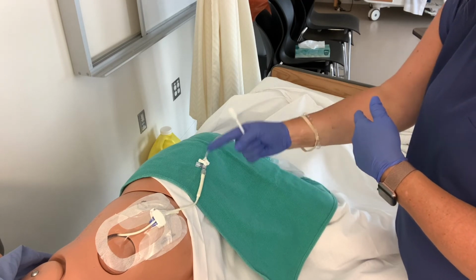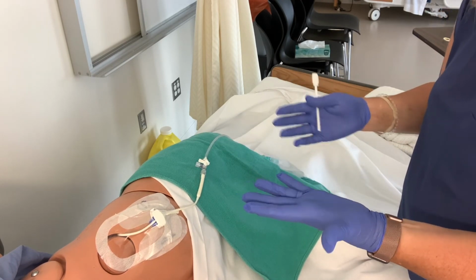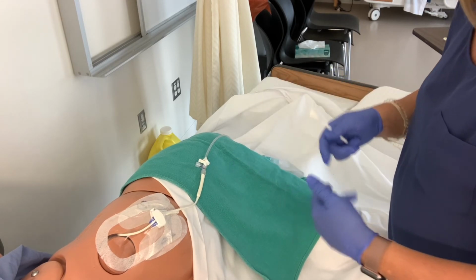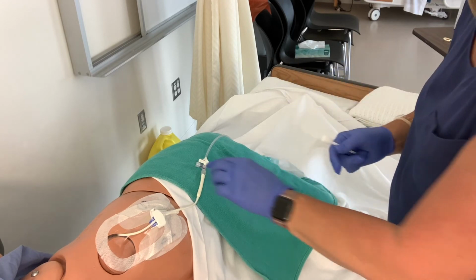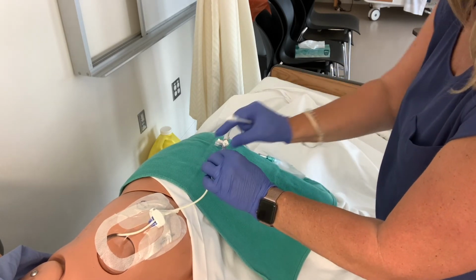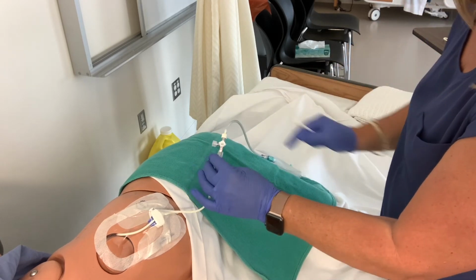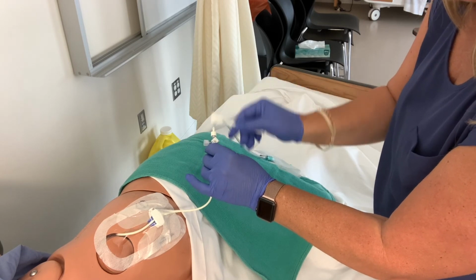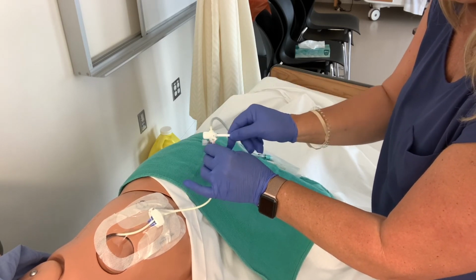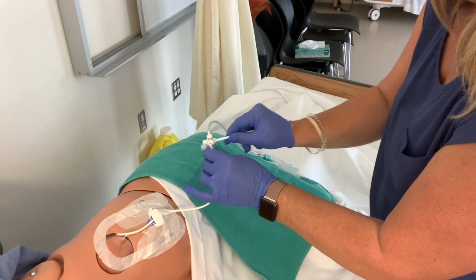So what I want to do is disconnect the old and assemble and attach the new. It's the same principles as before, but I don't have to use all the sterile touching when it's open. So I can lift this, I can turn this to the off position, because this is where it needs to be. Anytime I manipulate it, it needs to be in the off position. And I'm going to chlorhexidine swab the connection site where I'm going to disconnect from.